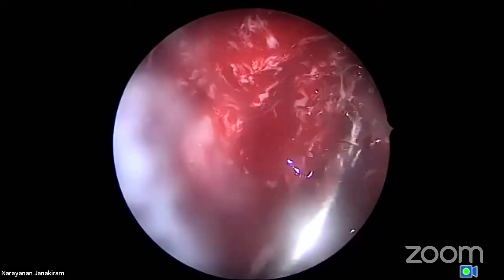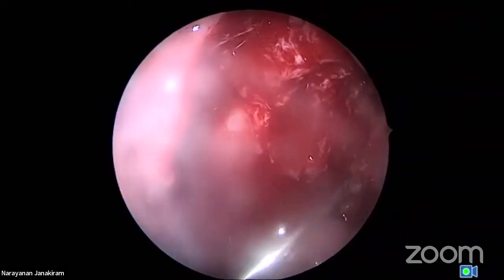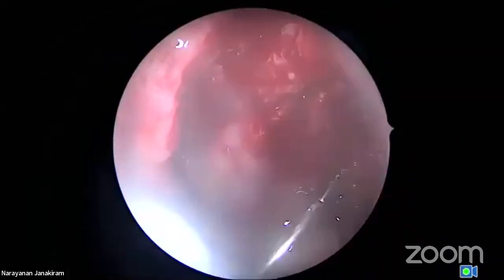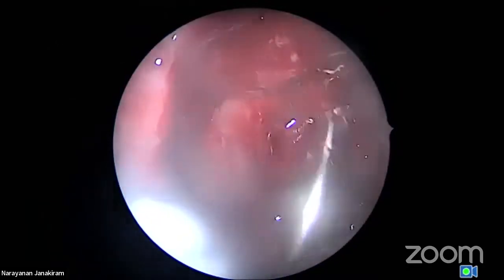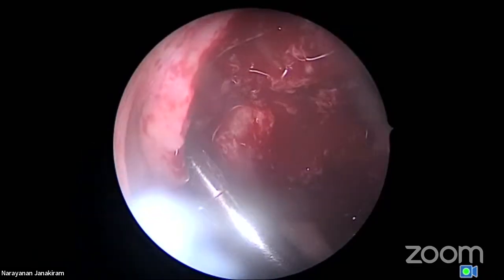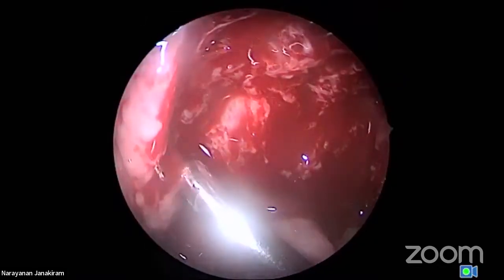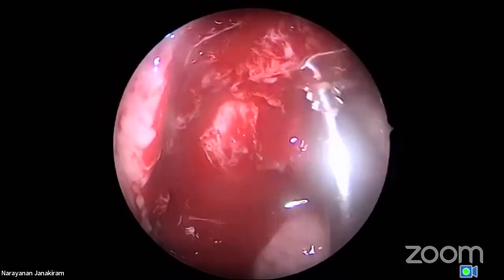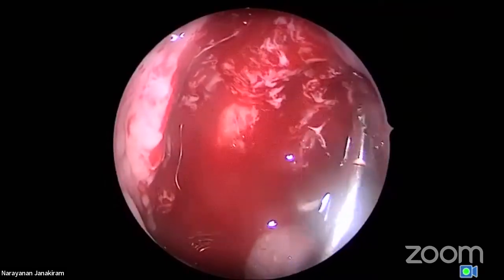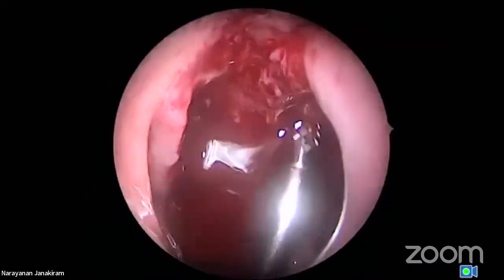You see here. I'm going towards the tubal tonsil. You see that clearly? I'm going between the, beautiful. Now I'm very happy. Scope. Keep irrigating, my dear friend. Oh, good. Leave it. Okay, so I have done my first step of debulking the adenoid.